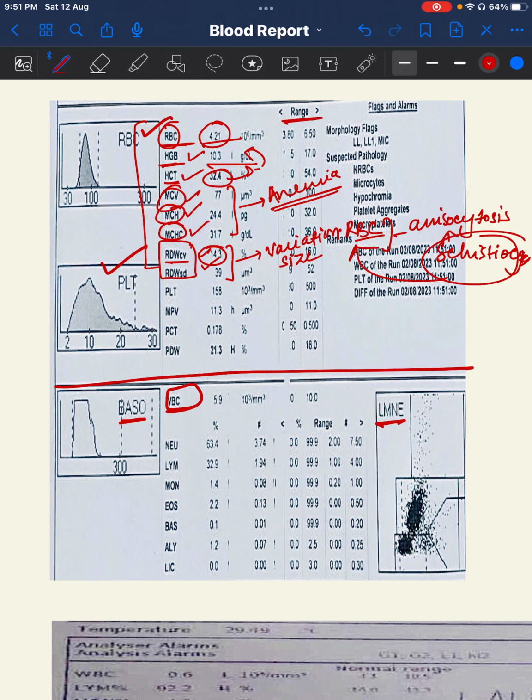Okay. So the next thing the report tells you about is the platelet. So you have this platelet graph also. Understanding these RBC, platelet, and lymphocyte graphs is a very, very, very extended topic, and I'll be taking a separate class for that because otherwise it will be all khichdi in your brains. So I don't want you to have that mix up of all the things. Just a basic idea of what all a CBC report tells you.